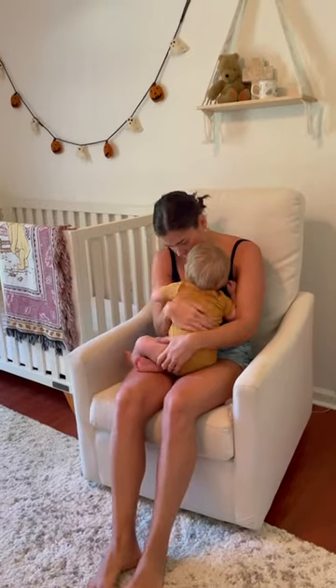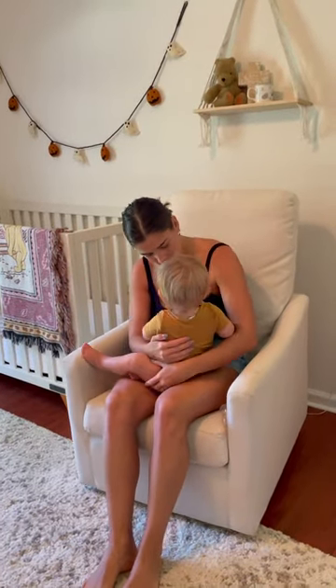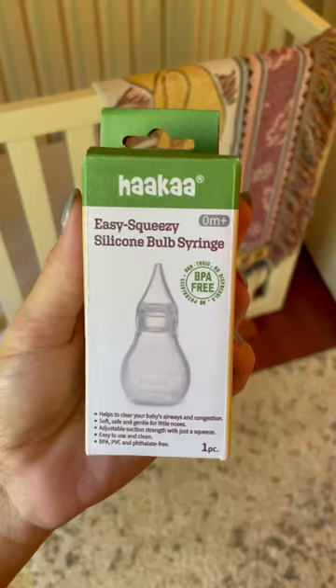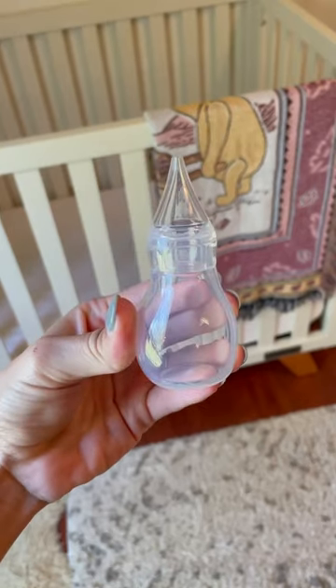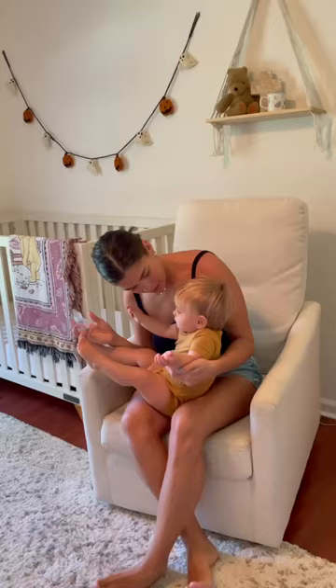This morning my son woke up with a runny nose. Thankfully I had this Haka Easy Squeeze silicone bulb syringe in my back pocket. This easy-to-use syringe helps clear your baby's airways with a super gentle suction.